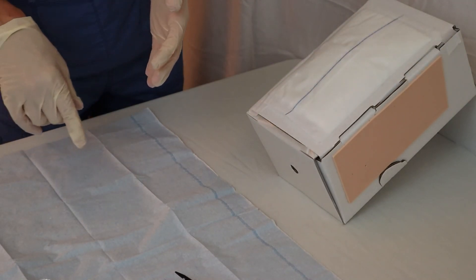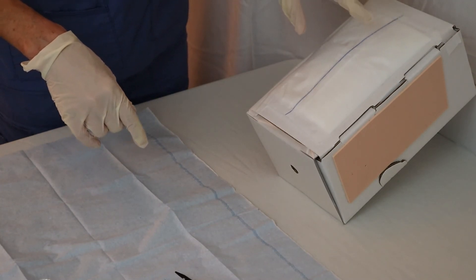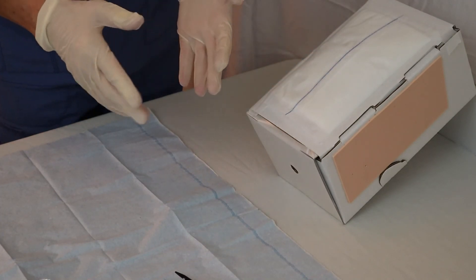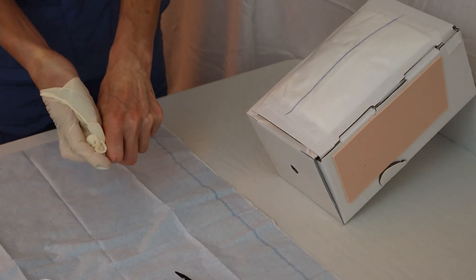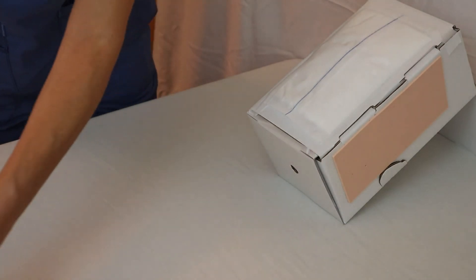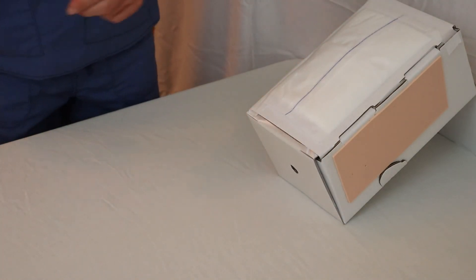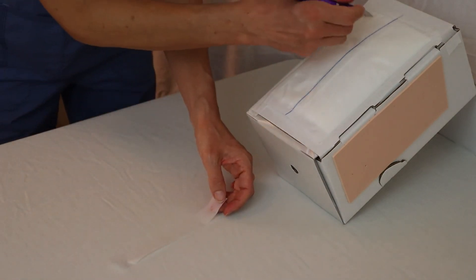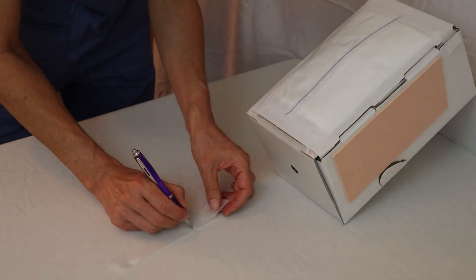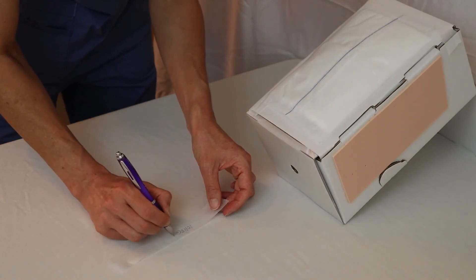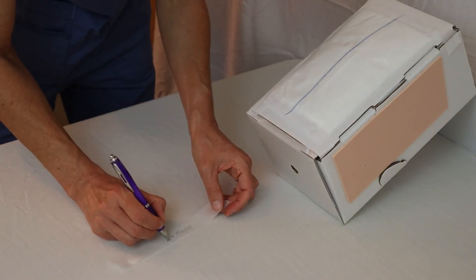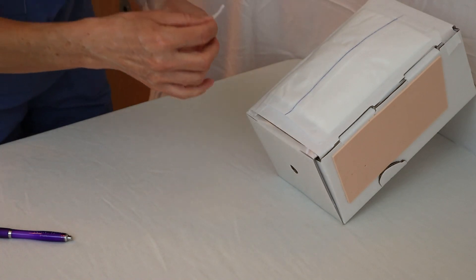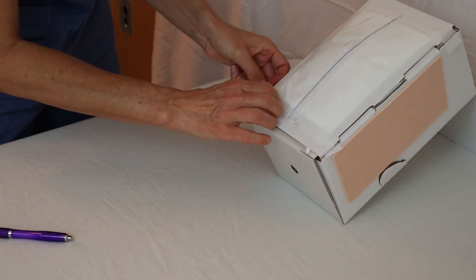Before I put on my last one, because I want to label a date, time and initial the dressing, but now I'm not sure if the gloves touched anything, before I reach inside my pocket and use my pen to do that, I'm going to take off my sterile gloves and discard all these contents here. I will do hand hygiene and then take my pen and label this last piece of tape because I don't want to write on the pad that might be very uncomfortable. I'll write the date and the time, 10:38 a.m., and I'll put my initials and then I'll put this last piece of tape right there.